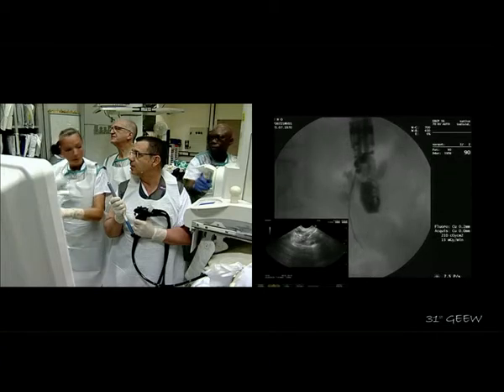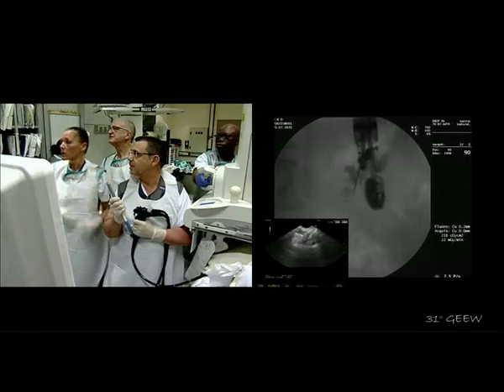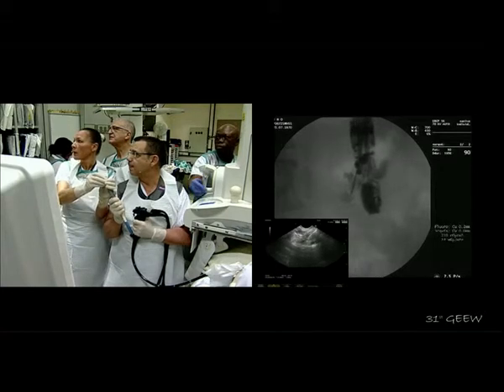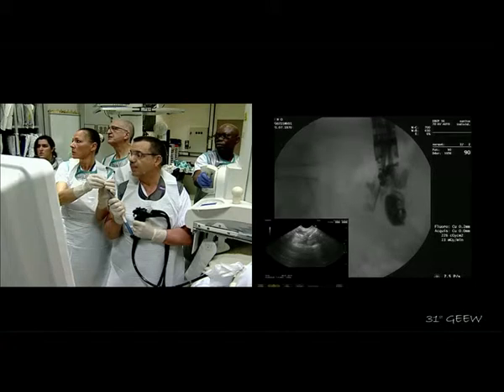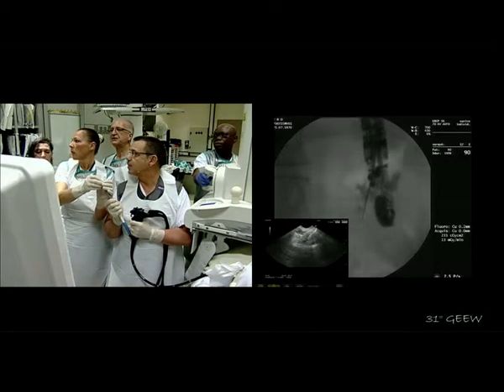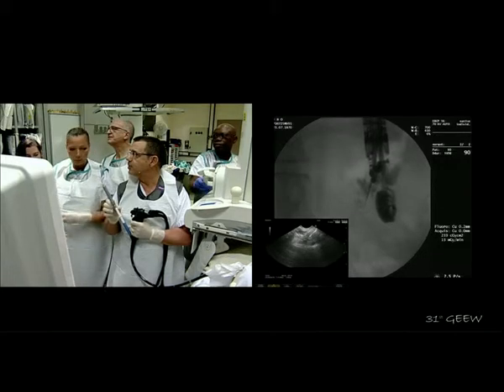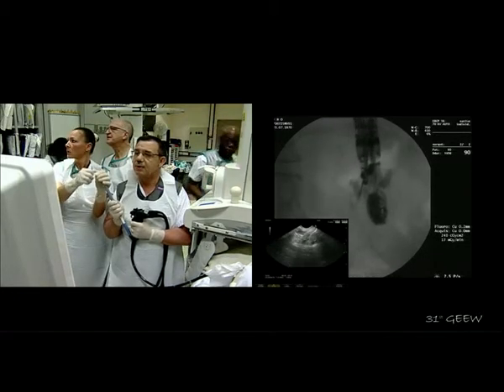Oh no. You are in the leak? Yes. Probably if you come back a little bit... Maybe you are too deep with the needle. Yes, if you can pull back a little bit. Okay, like this.